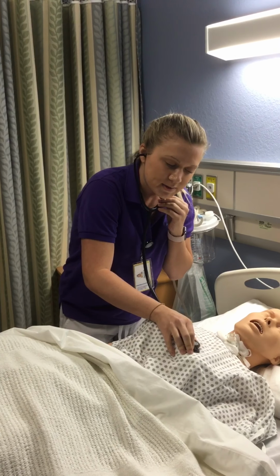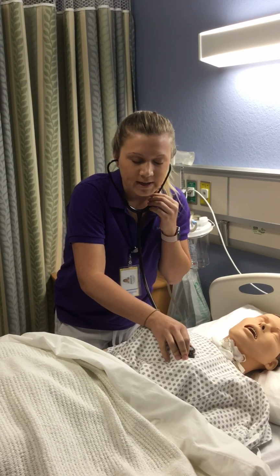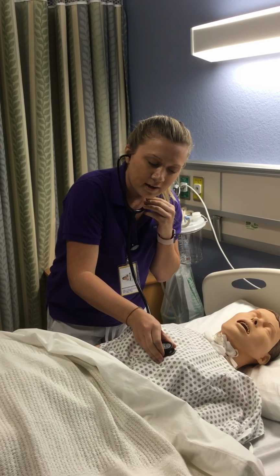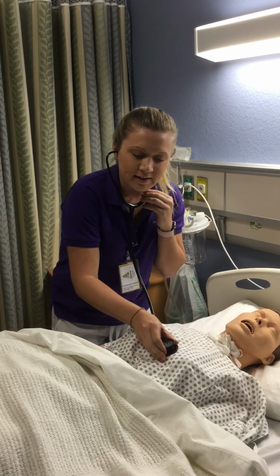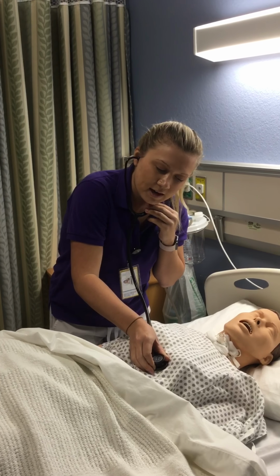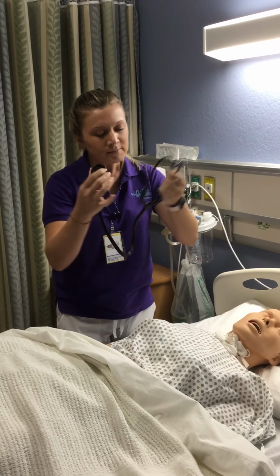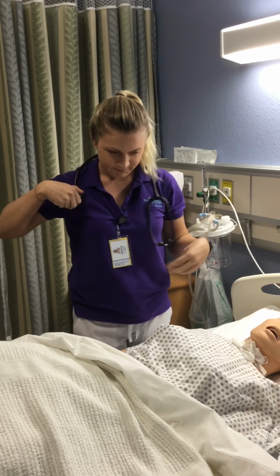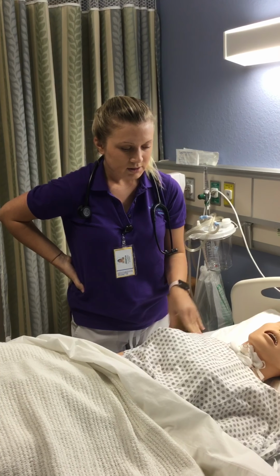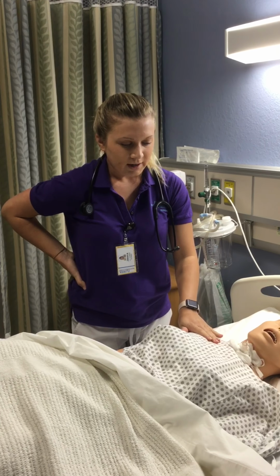Erb's point, which is left, third intercostal space. The tricuspid, left, fourth intercostal space, and the mitral, which is the left, fifth intercostal space. And you would go ahead and listen to the mitral for 60 seconds. It should be normal. So that will be all for the cardiac area.